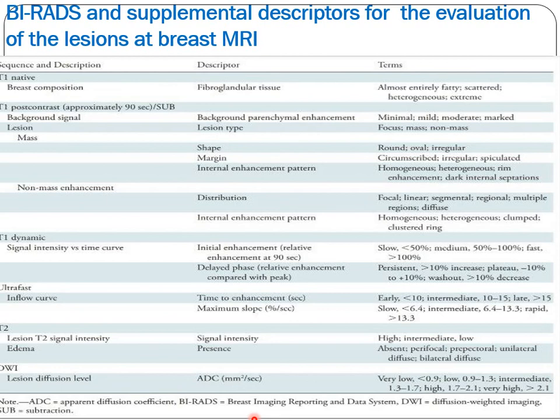Later on, you have to talk about the T1 dynamic series of images that have been taken after the first image, at 60 to 90 seconds after contrast administration.